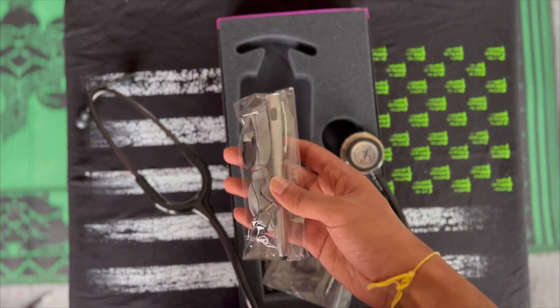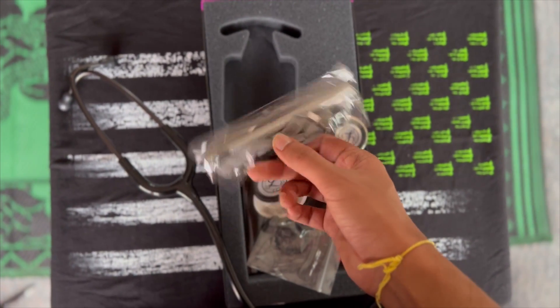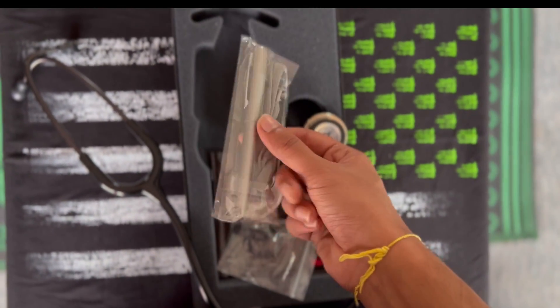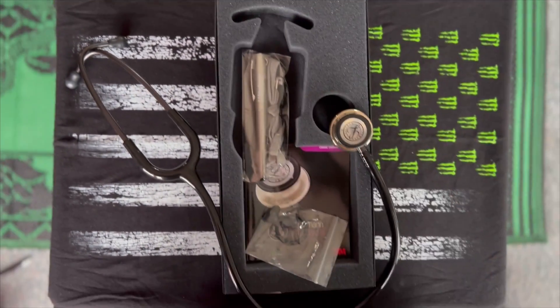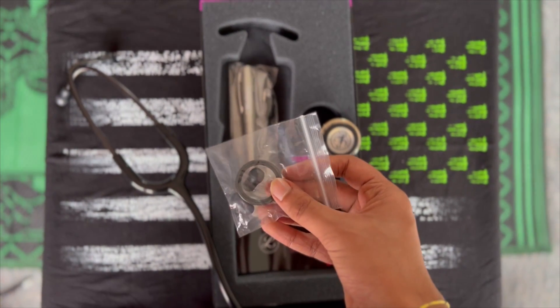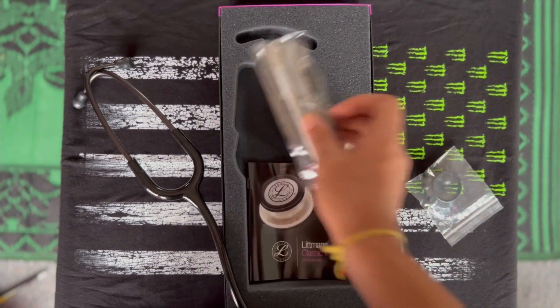Looking at the pen light — I thought I was going to have to buy that separately, but there it is. There's also a stylus at the very end: that's the light end, and that's the stylus end, and it's pretty light as well. Looking at the other package in there, that's another diaphragm for changing, and a couple of spare earbuds as well.